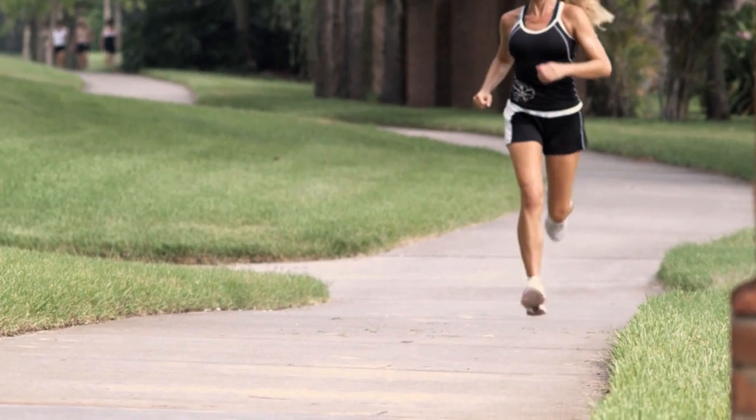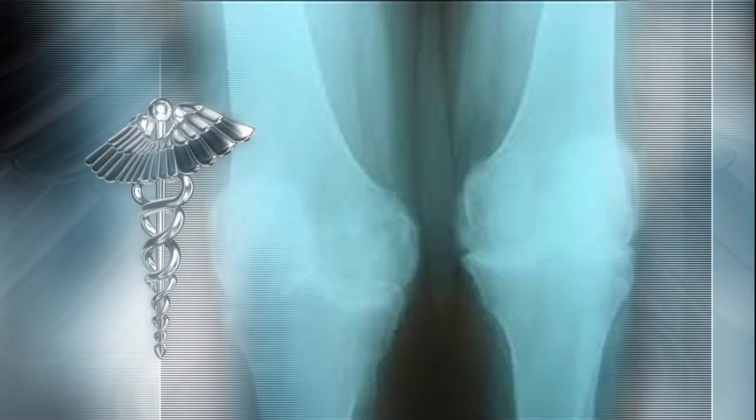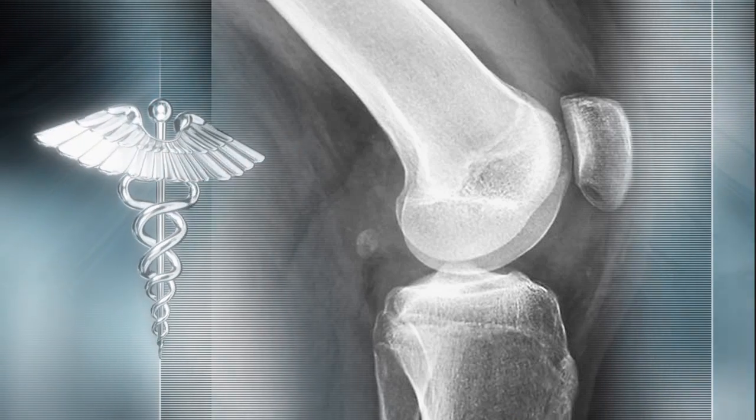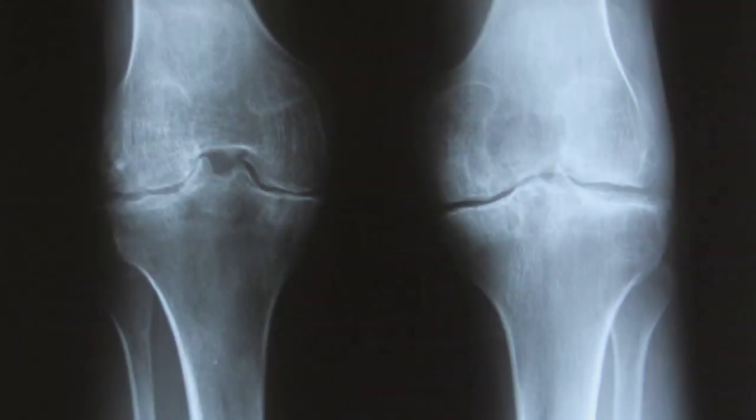In the younger population, they want to really feel like their knee is normal. They want to be able to do the things that they did prior to getting arthritis, and they want it to feel the same as it did normally. And we need a good deal more information than we have to do that. Standard imaging tests like MRI and X-ray only give non-moving views of the knee and do not account for movement and changing weight on the knee. Traditionally, what we've done is we've looked at a standing X-ray, which is a very static image that just shows what the alignment looks like when the patient's standing.